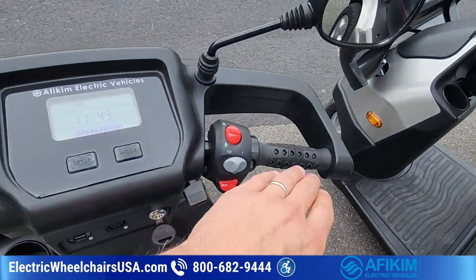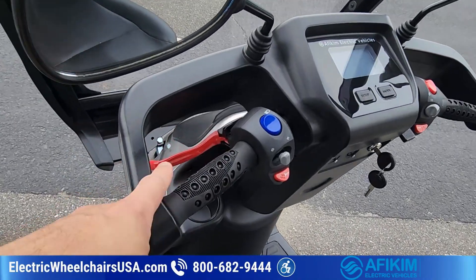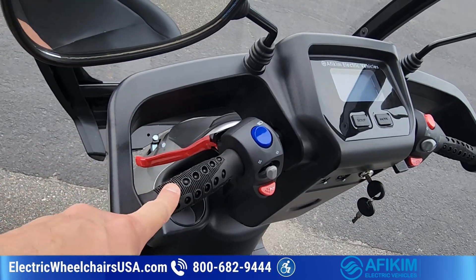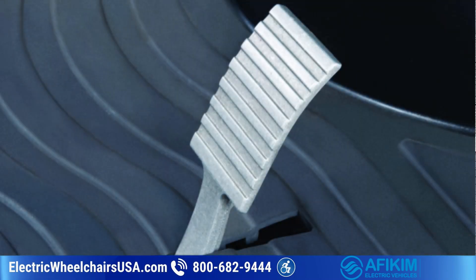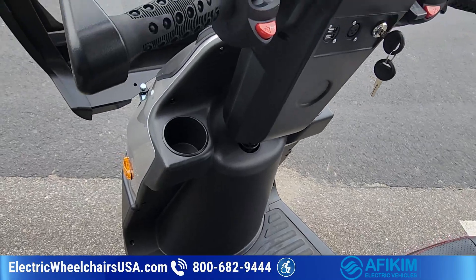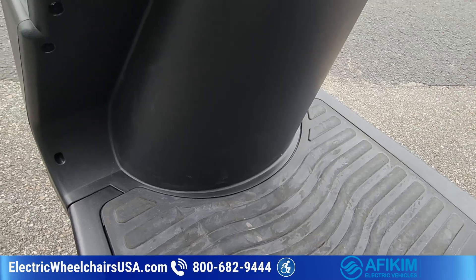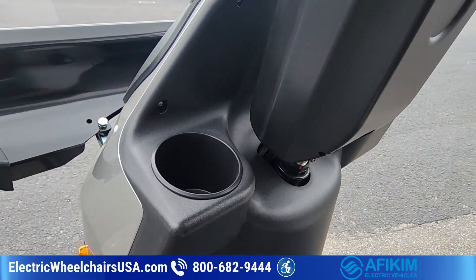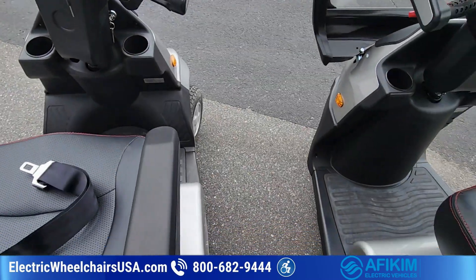Another customization available on both models: the throttle is on the right side by default, but if you're left-handed and want the throttle on the left side, just call us before placing the order. You can also get a foot throttle — it's like a pedal, similar to driving a car. There's a small switch on the tiller so you can toggle between the foot throttle and the standard hand throttle.